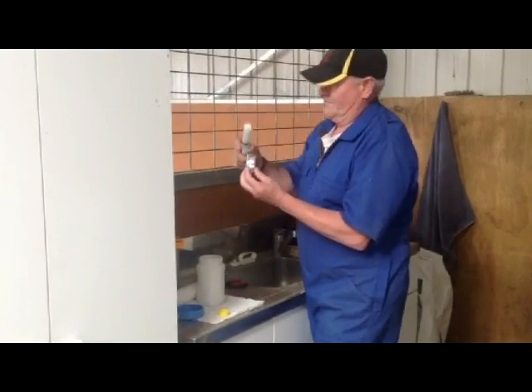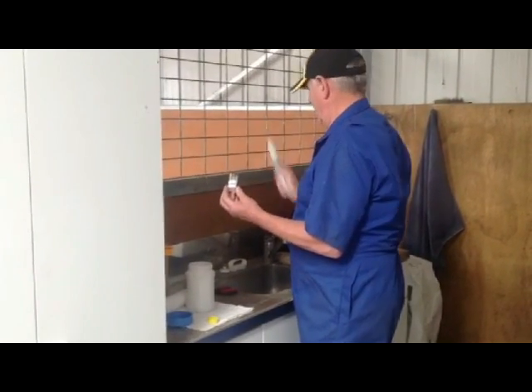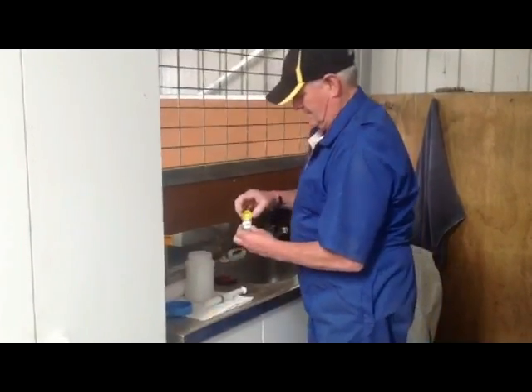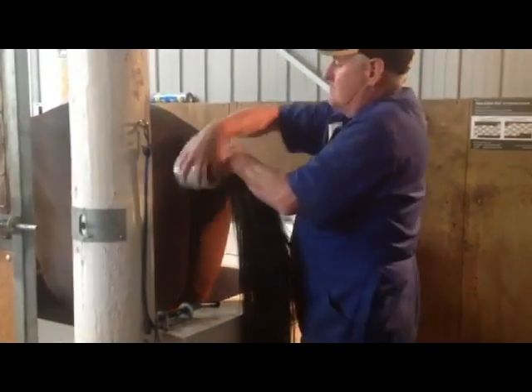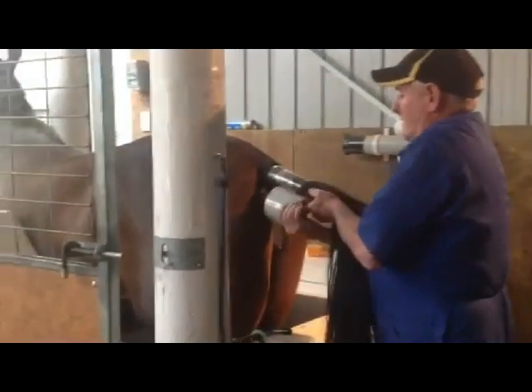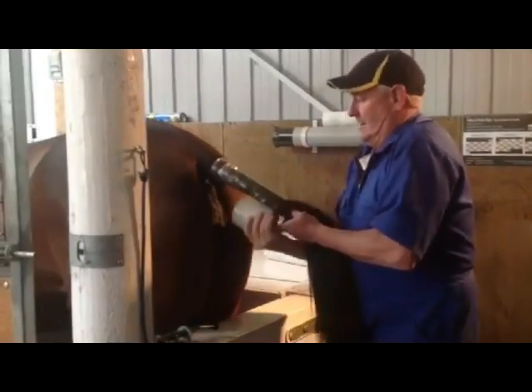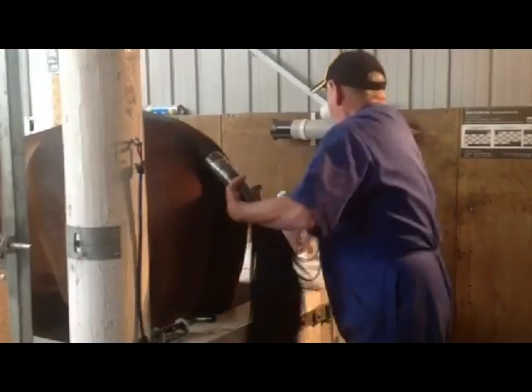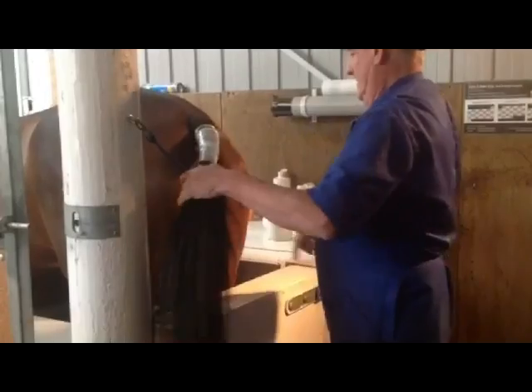The most important things around this area are to do with temperature, so that we don't give the sperm cells any sudden temperature shock. And most importantly, the semen is not subject to any direct rays of the sun. Those are the two keys.